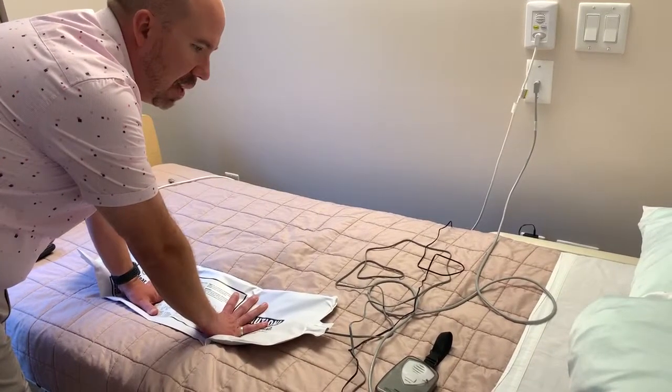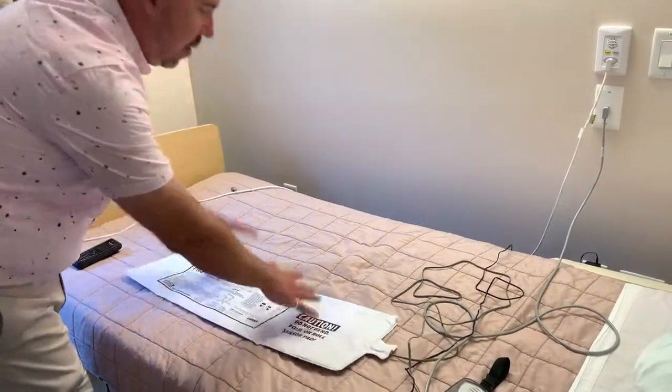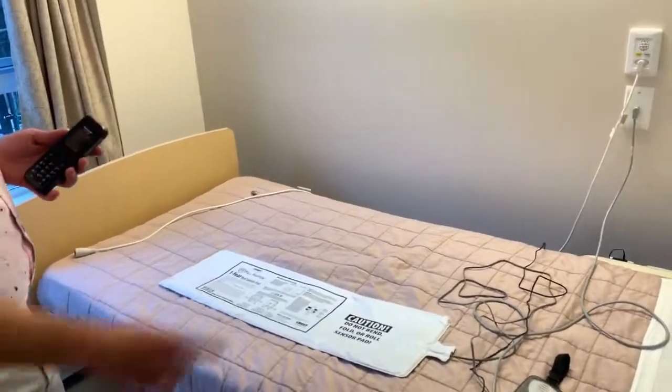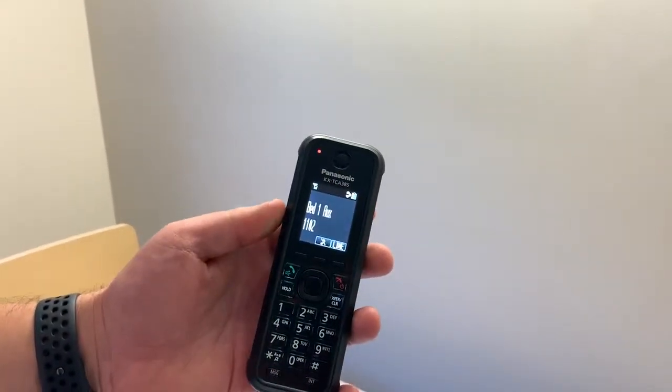So let's say a resident actually did completely get off. If it's the middle of the night or whatever, and they get out of bed and you didn't want them to, they're going to get off the bed, and after a couple second delay, we're going to actually get the call station. We'll start blinking cancel, showing there's an active call. And on the phone, we have bed 1 auxiliary in room 1102, which we're in.